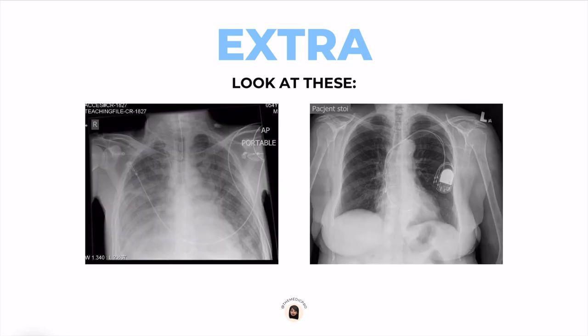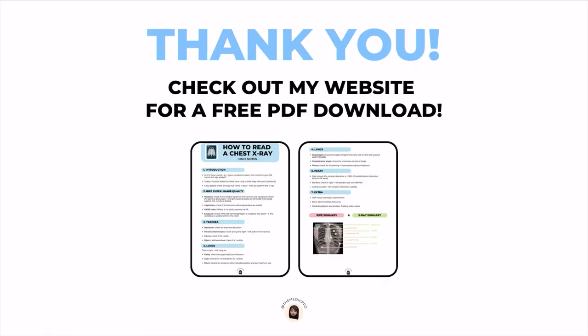Here's what that looks like on an x-ray. On the x-ray on the left, you can see an endotracheal tube. And on the x-ray on the right, you can clearly see the ECG leads. Now that's it — you've successfully analyzed and interpreted an x-ray to ace that OSCE station. Well done.